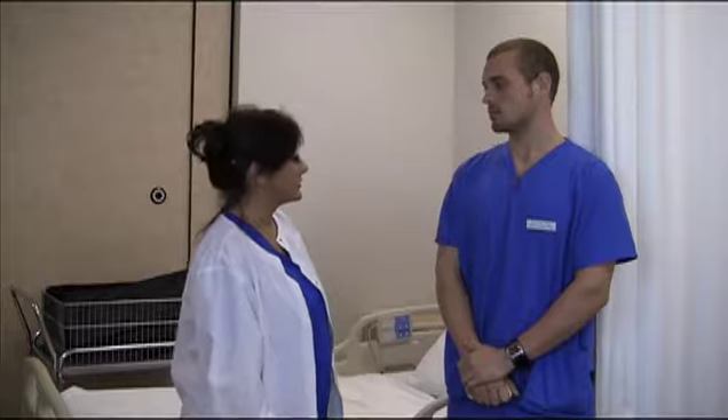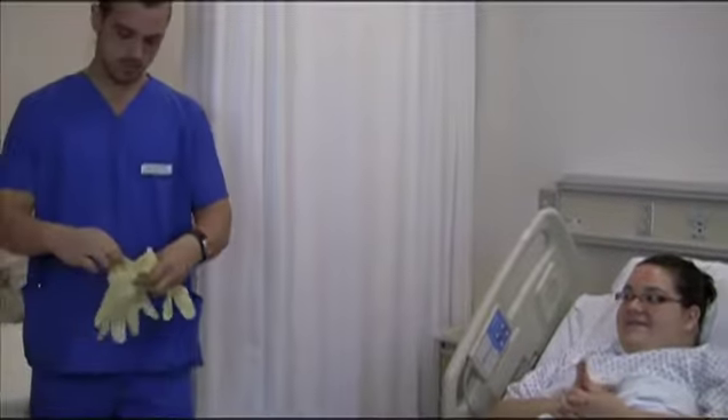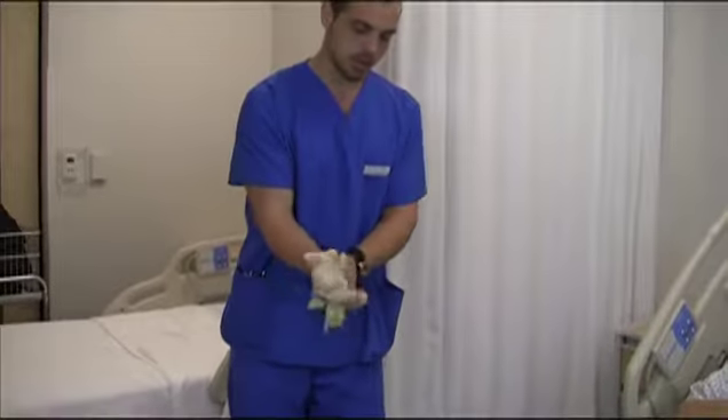Obtain direction from licensed nurse. Identify the patient. Explain the procedure to the patient. Put on gloves.